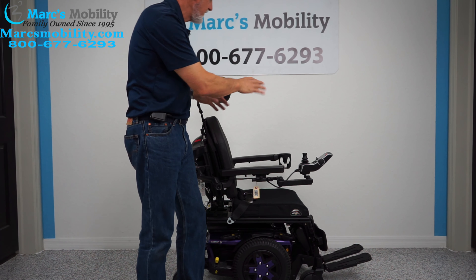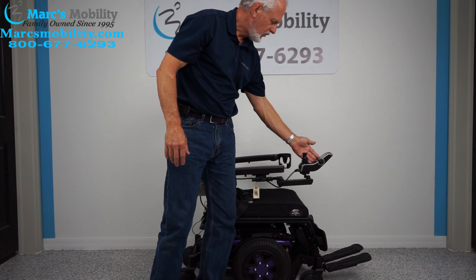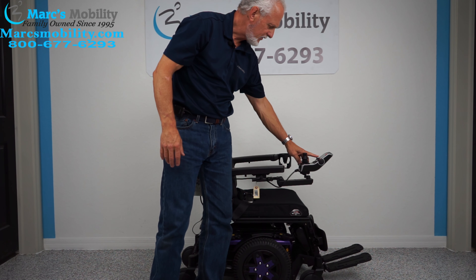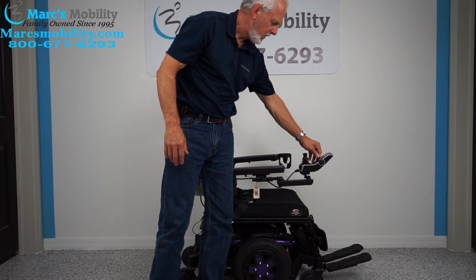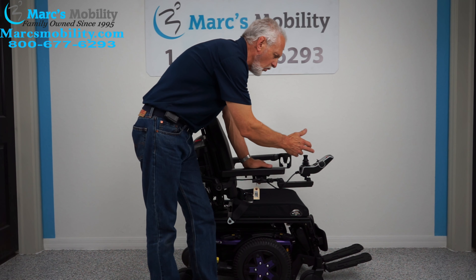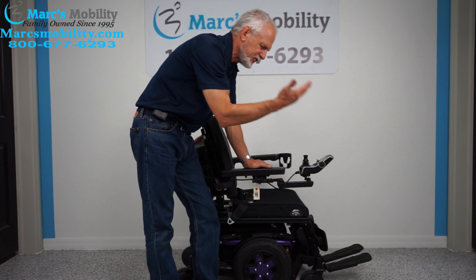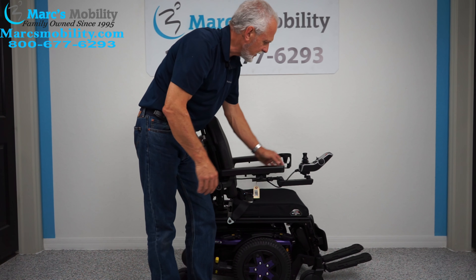All the functions on this chair can be worked through the joystick. You go to the joystick right here and there's a button on the left. You keep pushing forward until you see a picture of your seat on the screen. When you see a picture of the seat, whatever is yellow on it — right now we have the bottom and the back yellow — that would be the electric tilt, so that's what I want to start with.